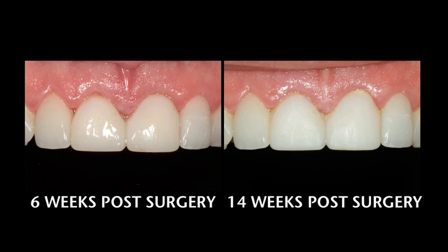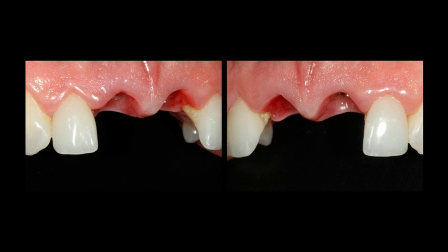The implants are osseointegrated, we feel, at this point, but the tissue is a little blunted looking, so I now want to change the provisional contours to change the tissue contours. So if you look here, the patient had less than ideal oral hygiene. We did tell him to be really careful with this, but his oral hygiene wasn't quite as good as we would like, so we want to clean all this up.